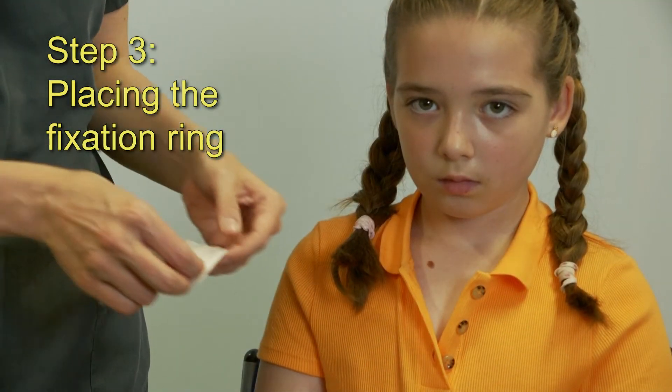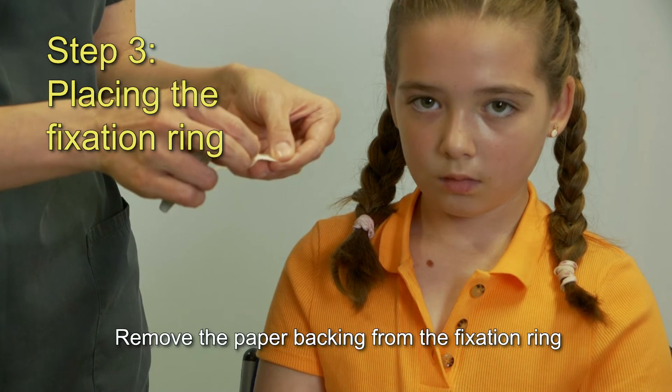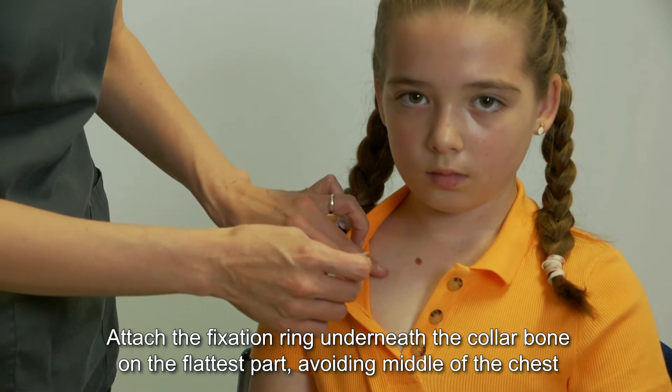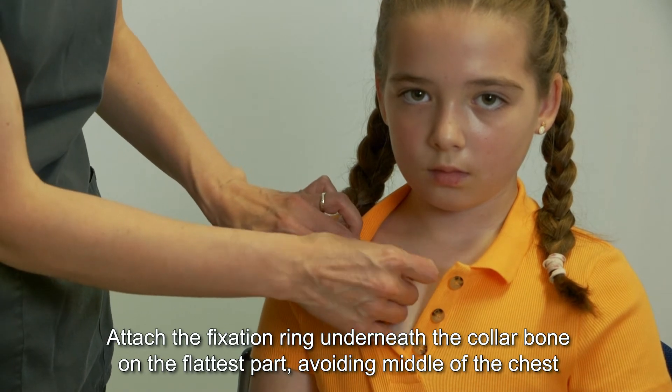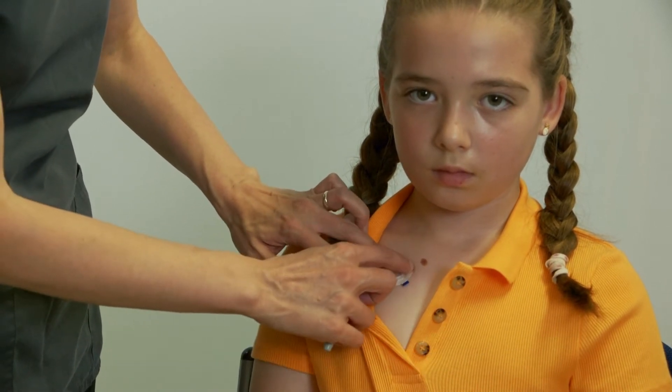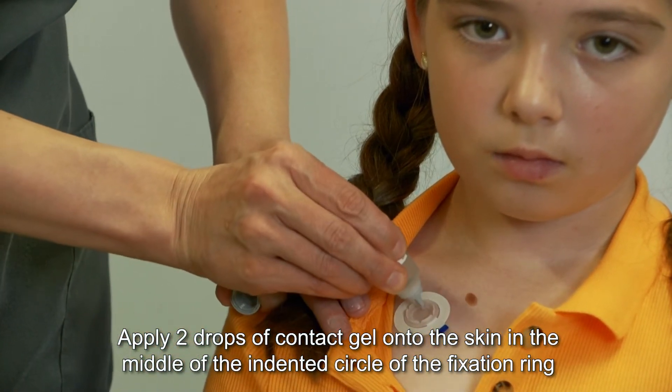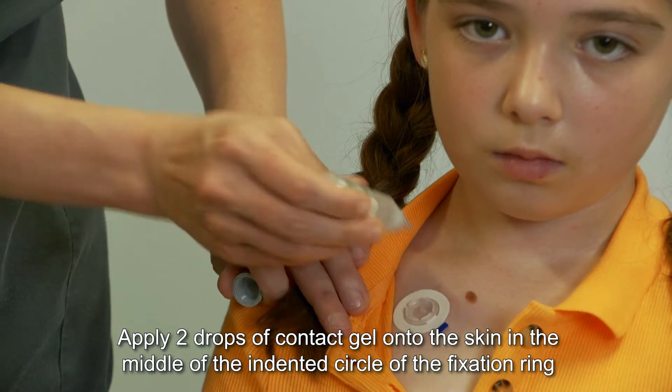Step 3: Placing the fixation ring. Remove the paper backing from the fixation ring. Attach the fixation ring underneath the collar bone on the flattest part, avoiding the middle of the chest. Apply two drops of contact gel onto the skin in the middle of the indented circle of the fixation ring.